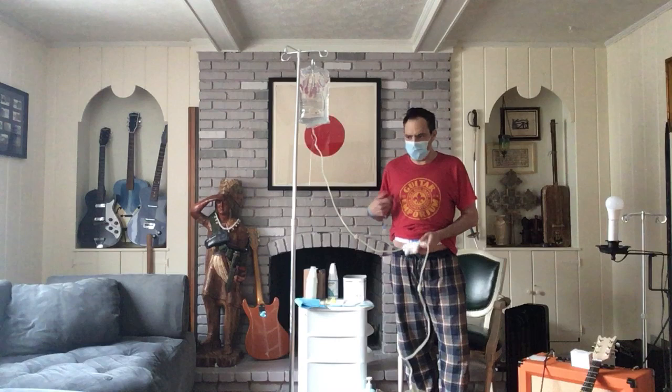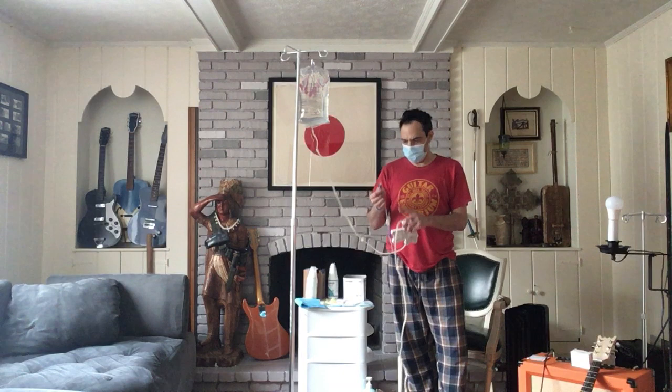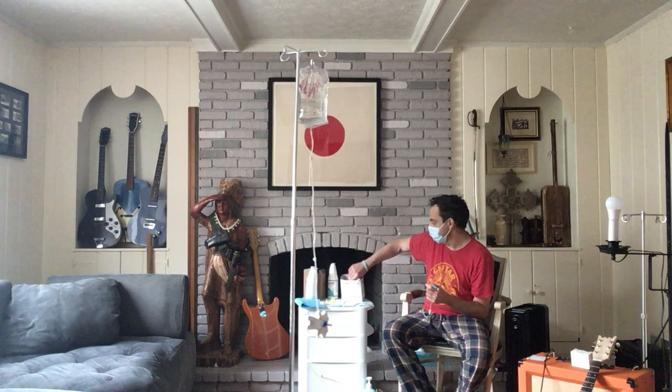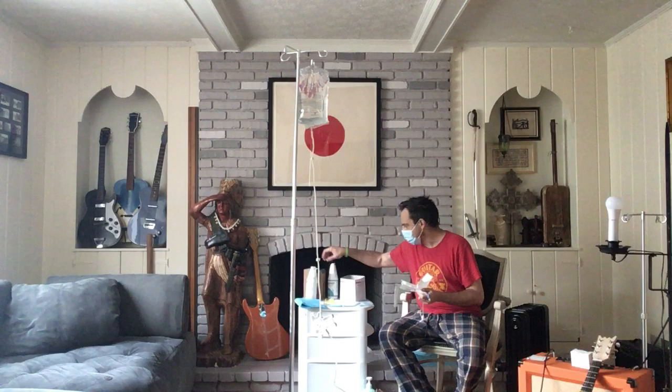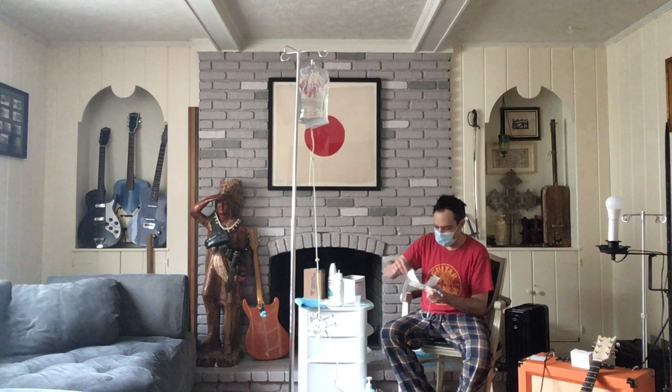Yeah, so we're going to take that. This is our lifeline. It is sterile inside of this. Surgically sterile. Just clamp right here. A little twist off port right here. And we're going to make sure that stays as clean as possible. If that gets dirty, well, call the clinic. We're going to open up another sterile pack. The best way to do this is to spray it right inside of the little package it comes in. That tends to work.